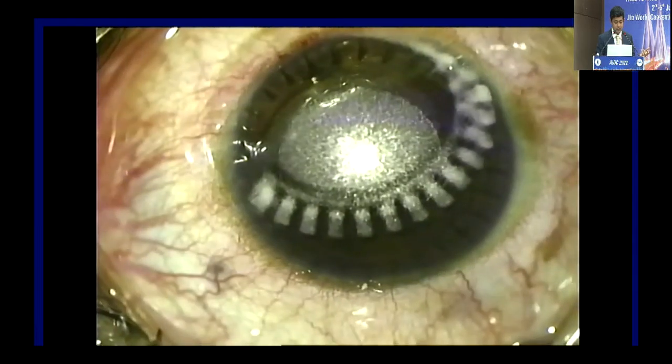And because there were only 2 seconds left on the laser, the side cut happened because I had not taken my foot off the pedal, thinking it was a suction loss. So this treatment was completed, and as you can see here, this is where the secondary cut has happened. I was not very sure what I should be doing at this point of time. I thought I'll treat the other eye, come back and think about what I need to do here.